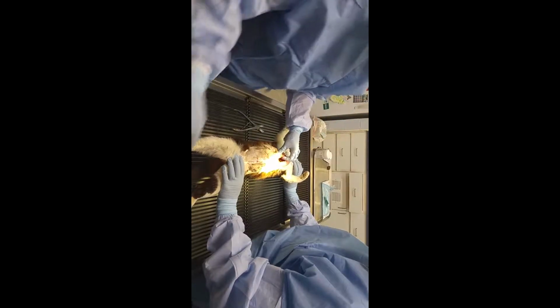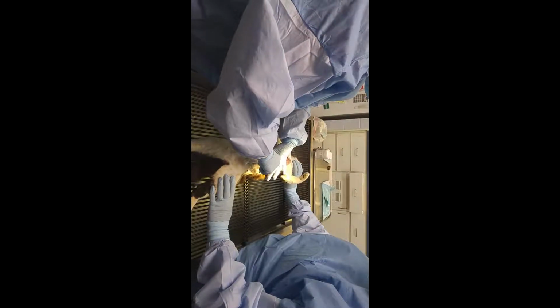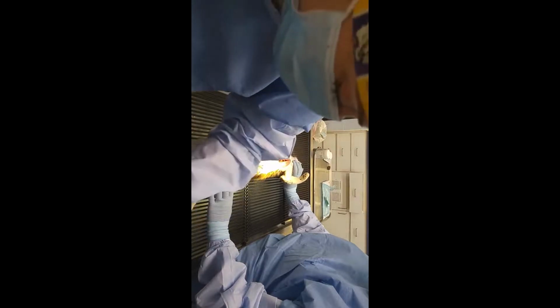So we're going to go ahead and incise into the abdomen at this point. Based on what I'm feeling in her abdomen, I think we're going to find some things going on there potentially.